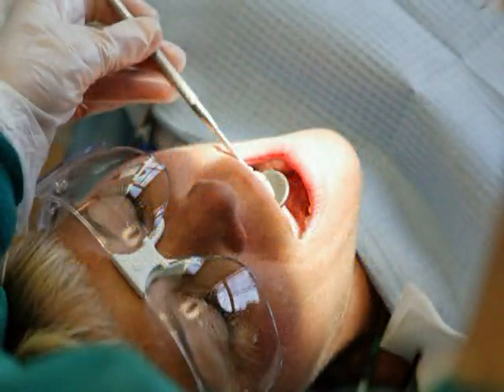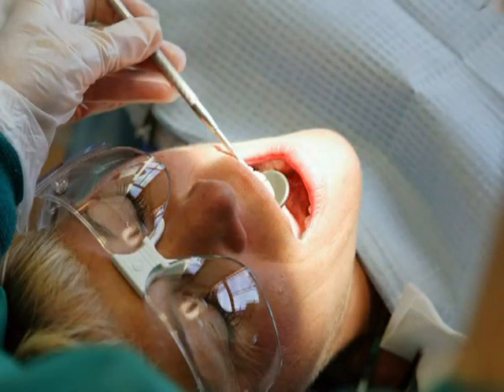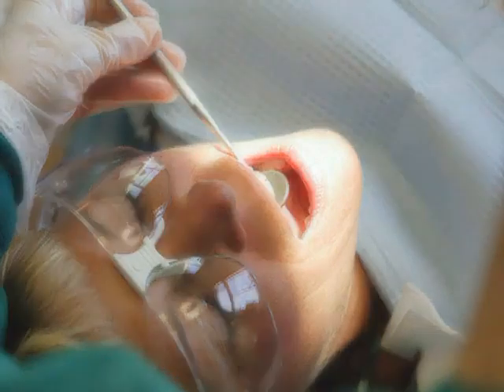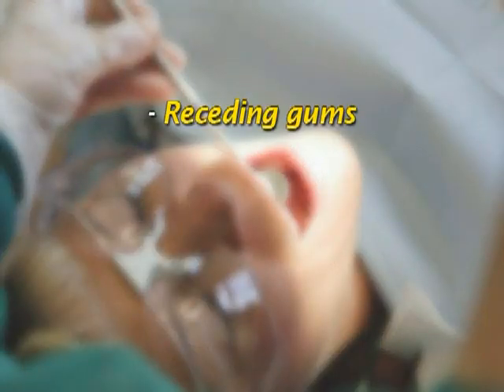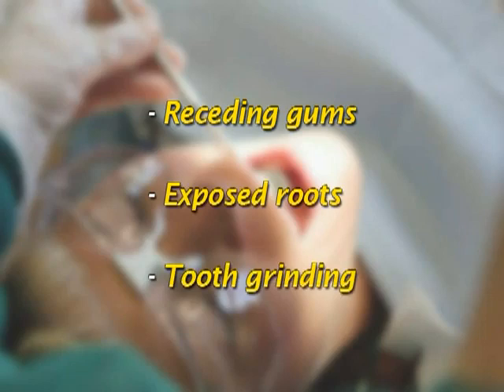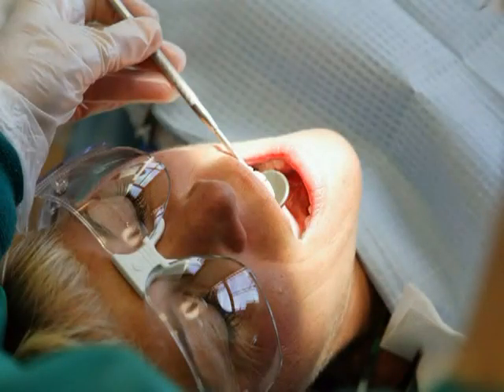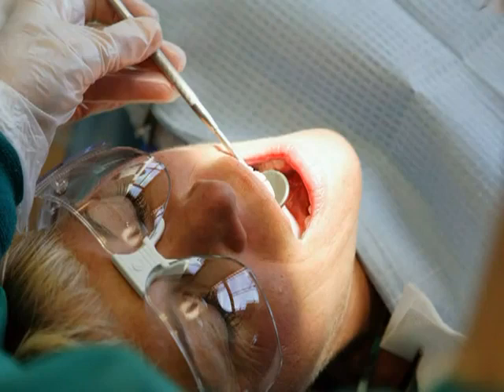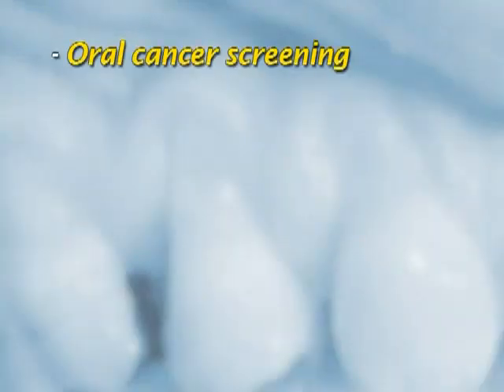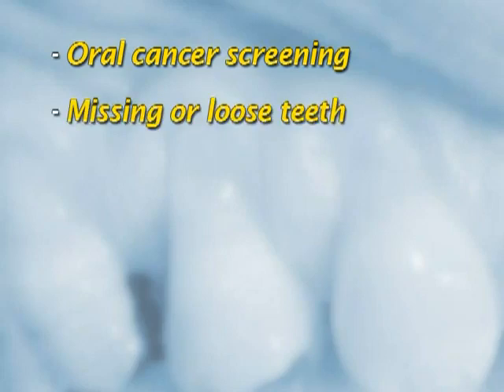A periodontal examination and probing helps your dentist diagnose the gum diseases gingivitis and periodontitis, and also checks for receding gums, exposed roots, tooth grinding (bruxism), and other problems. Here's what your dentist will evaluate during a periodontal examination and what to expect: oral cancer screening of the inner cheeks or tongue, and missing or loose teeth.